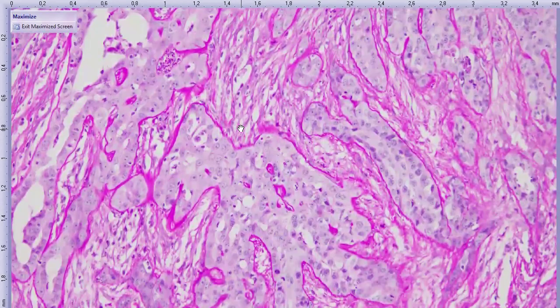All right. Well, famous last words are, this doesn't look like a melanoma, right? And then the thing becomes a melanoma right in front of you, because melanomas can do whatever they want. I'm going to go there. This doesn't look like a melanoma, but I wouldn't be surprised if a melanoma can mimic this. You may also just be suggesting that it would be very difficult to differentiate the two definitively. I agree. That's the reason we offered IHC, but we didn't go for it.